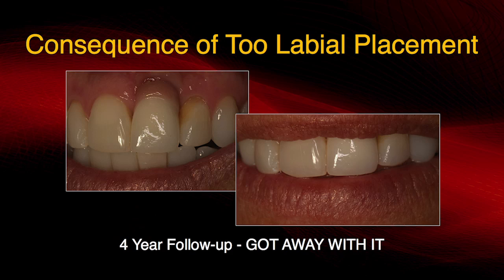So basically, we have to prepare directly on the implant, smooth the threads, create a finish line as if you were working on a tooth, and creating a margin and taking a direct impression. And then the laboratory has to be creative in making a ceramic metal crown here with a porcelain, pink porcelain gingiva.